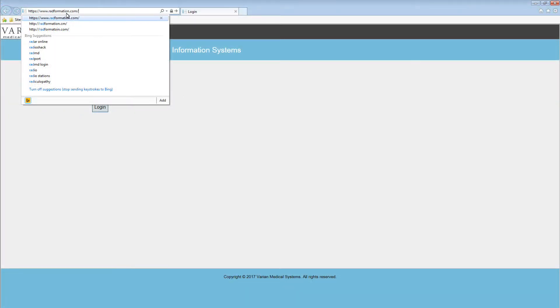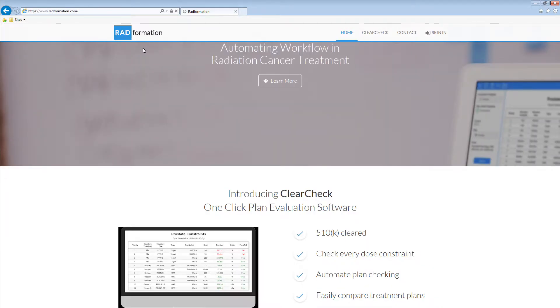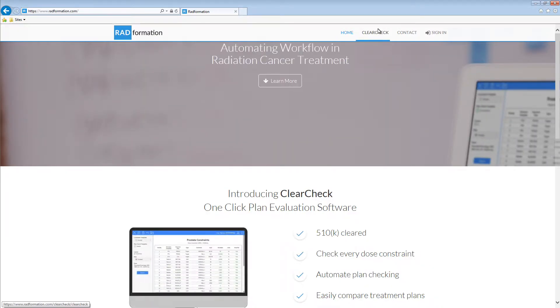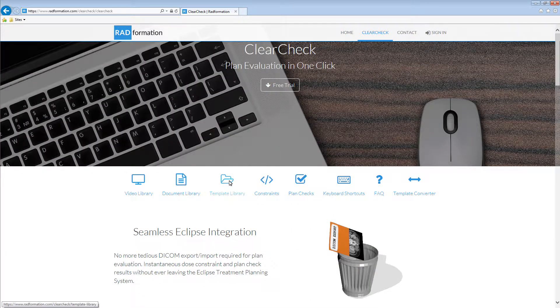First, we are going to download a constraint template from the Radformation website. Start up your web browser and go to radformation.com. Next, click on the ClearCheck link. Then, click the Template Library link.